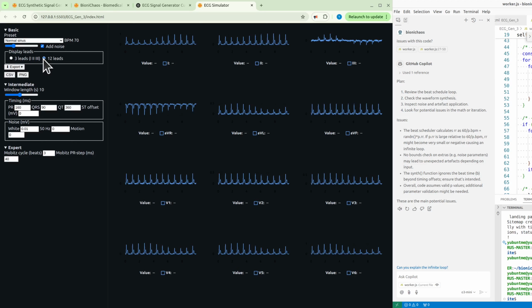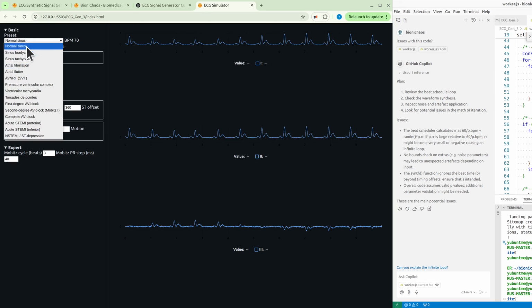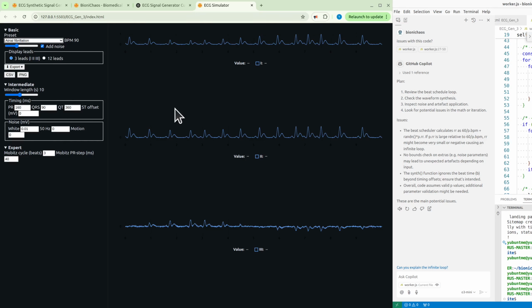You can switch between 3 leads and 12 leads. ECG can change your BPM, beats per minute, and have different conditions as well. But we really need an expert to check this. In A-Fib, yeah, have this variability between the peaks. And we'll keep testing it next time.